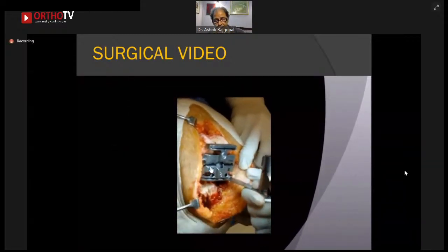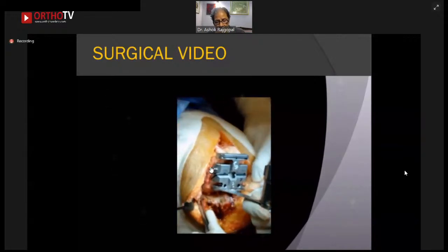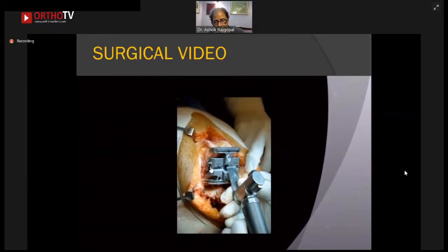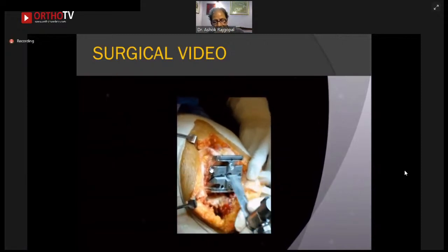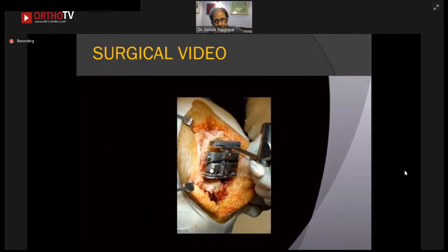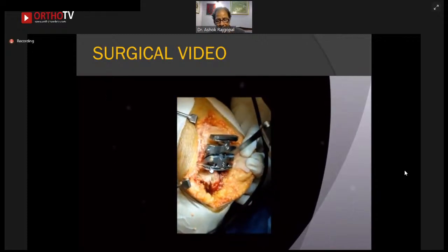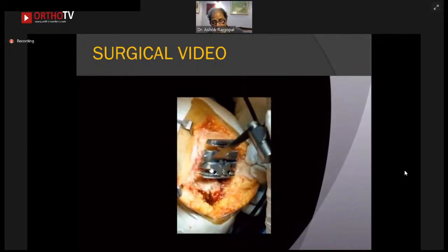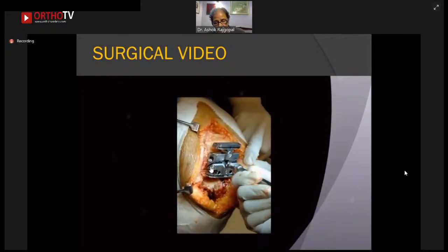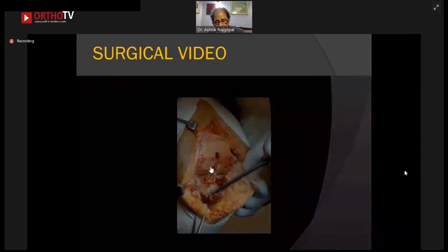This is your femoral finishing guide. So it's a pretty robust cutting jig. You can see through the bones, and that makes it a little less challenging. We don't really have a particular methodology of what cuts we do first or second. We just do them differently, I guess, each day. But at the end of it, that completes your femur.